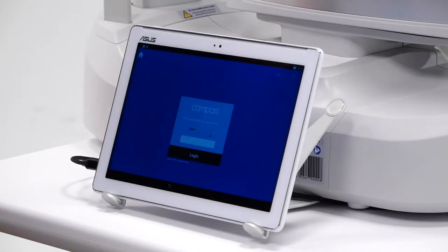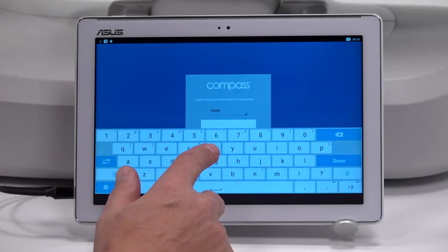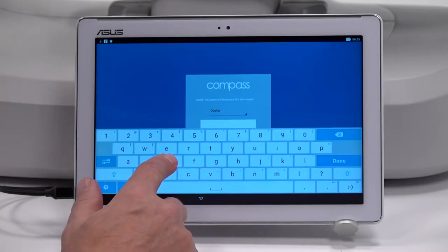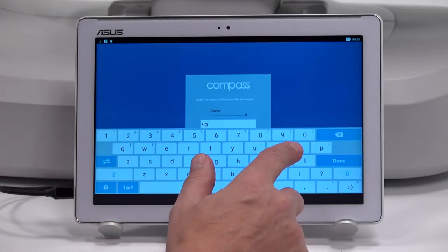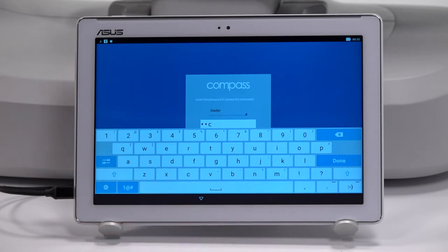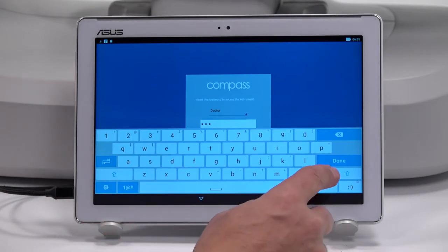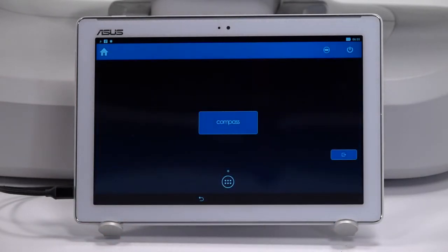Upon initial boot up, the compass tablet will display the login screen. The default password is 'doc'. Once entered, the compass button will appear on the tablet.